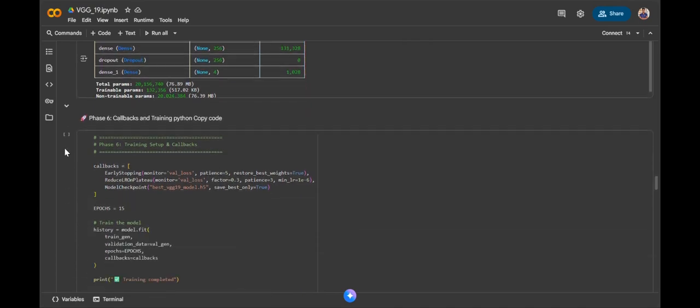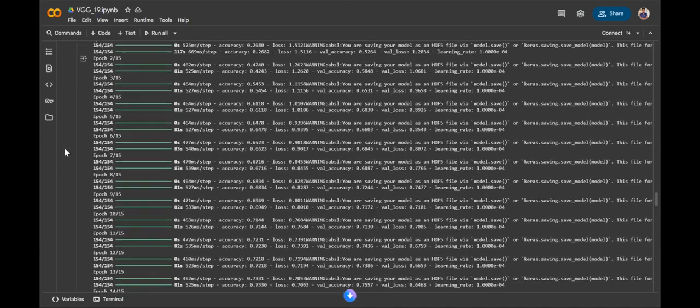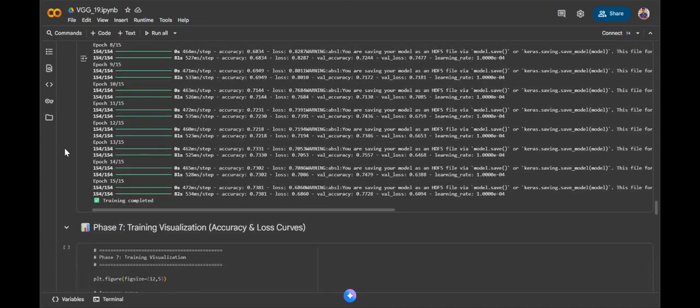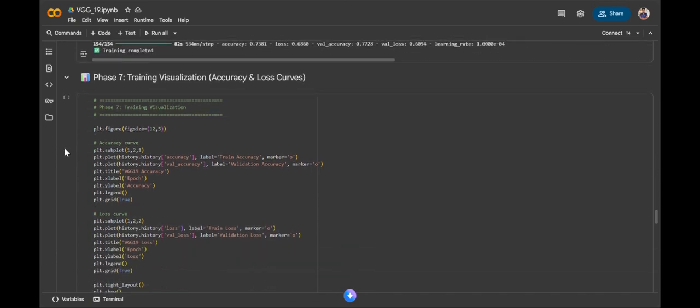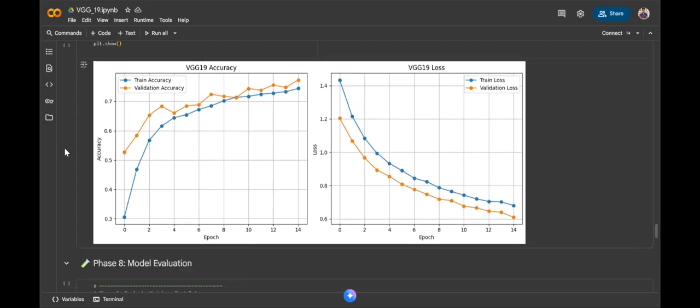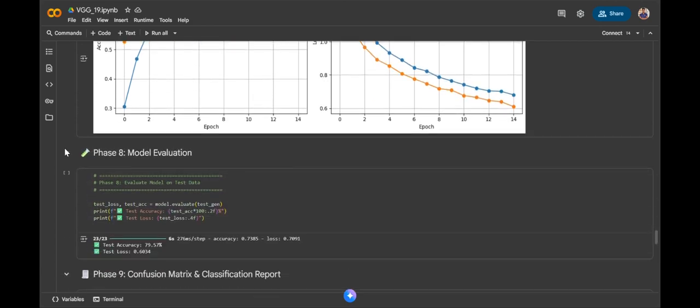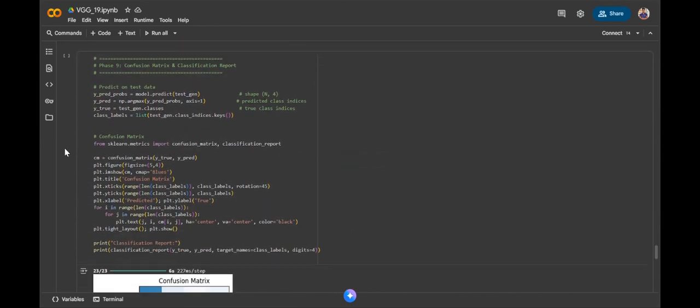We also hope to integrate explainable AI methods, allowing doctors to see exactly which parts of the image influenced the model's decision. This will make AI tools more trustworthy and transparent in medical environments. Through this project, we learned not only about the technical challenges of training deep learning models but also about the real-world impact of applying AI to healthcare problems.